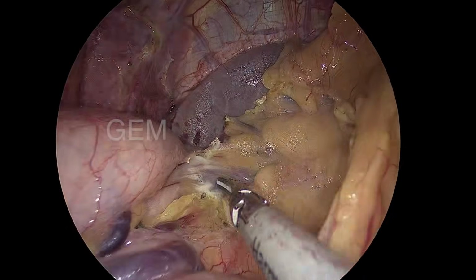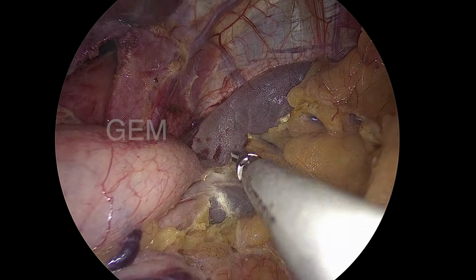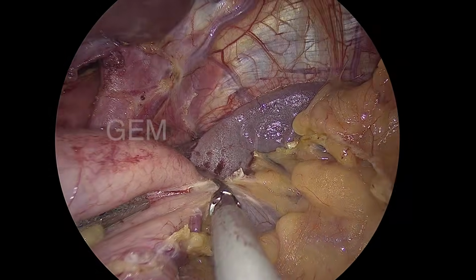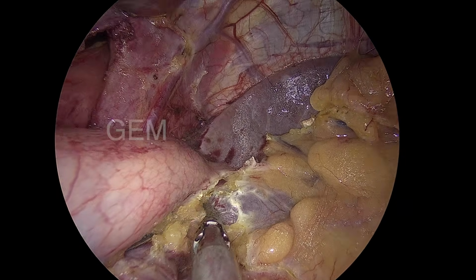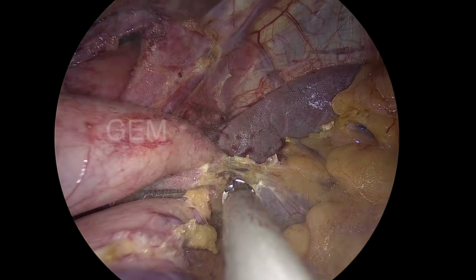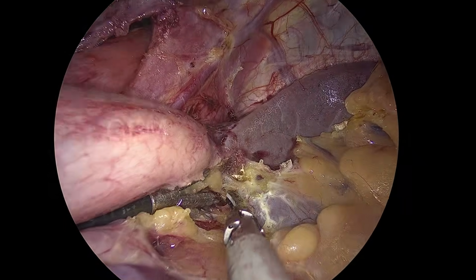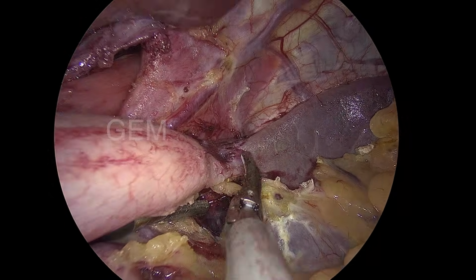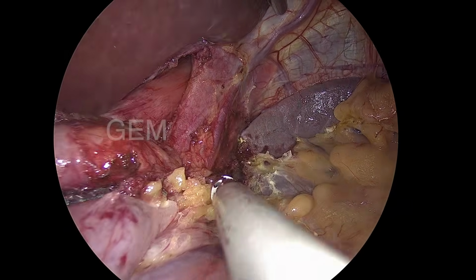I observe that in most patients with Hellers, the fundus will be very small, and sometimes after mobilization I cannot complete the posterior Toupet because of the very short fundus, and rarely I have done anterior 180 because the fundus is very short. Most of the time I am able to complete with the posterior 180.